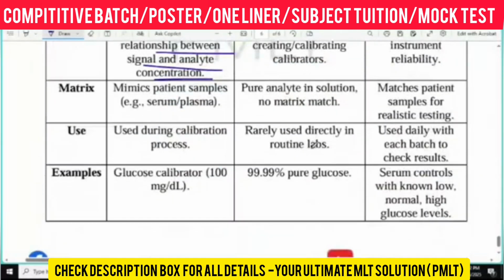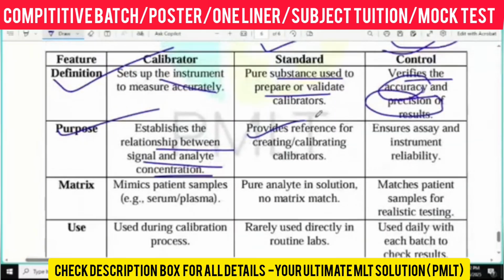So it is basically creating the relation between the unknown concentration and the known concentration. Understood? After that, the standard will give you the reference range. Control will ensure that your instrument is proper.